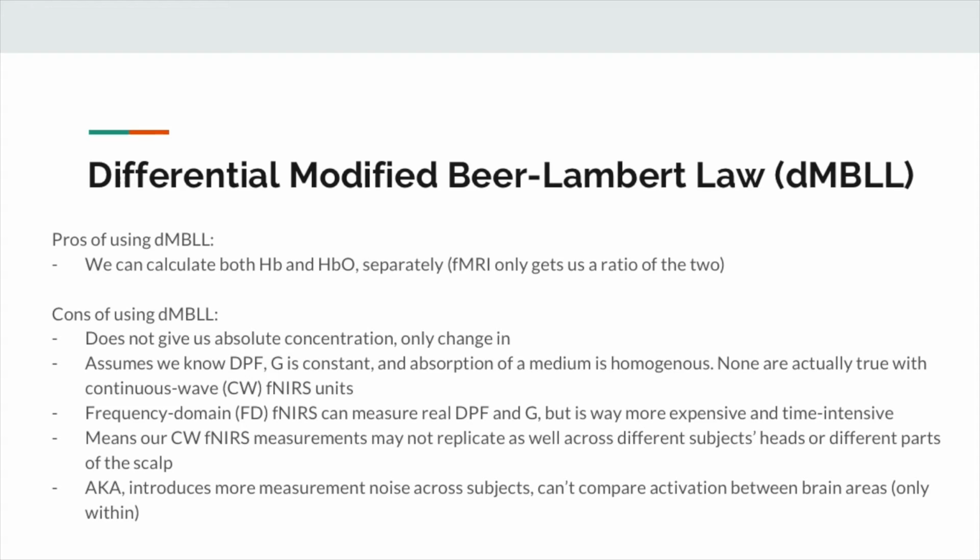It's not really practical, it takes a lot longer to run, and just very few of those really exist commercially. Most people who've done it have built their own, and so it's not really practical for our purposes to use. It's more of a thing that people keep developing when they're focused on, you know, the physics of fNIRS instead of using fNIRS for something else like we are.